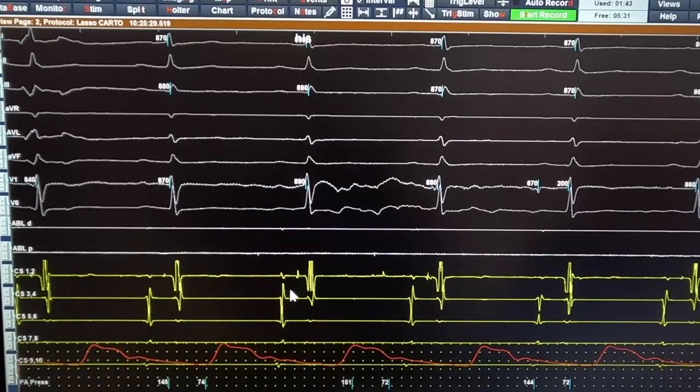That may be confusing, but as I previously said, it is important to observe the behavior of the potentials during catheter manipulation. If you see a large atrial potential on your catheter that is on the tricuspid annulus and a small far field of the ventricle, it means you are too much on the atrial side. If you push the catheter, then you should observe a change of the proportions: higher amplitude of the near field of the ventricular activity and a far field of the atrial activity.